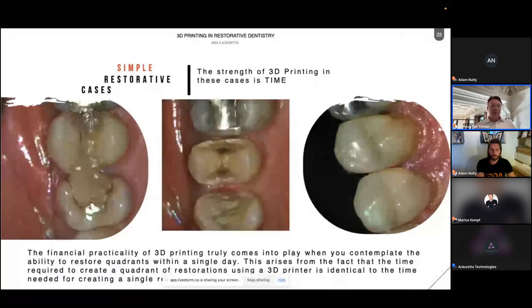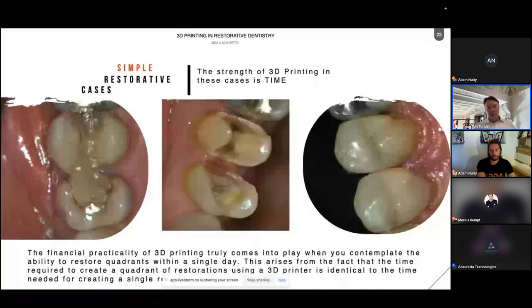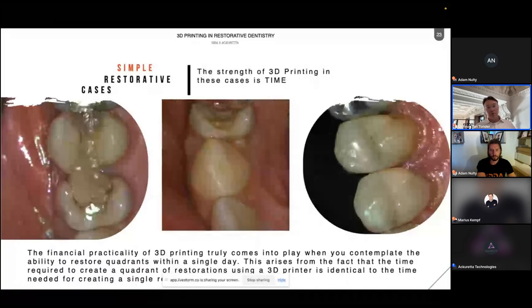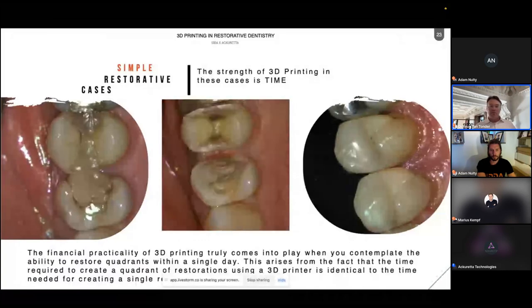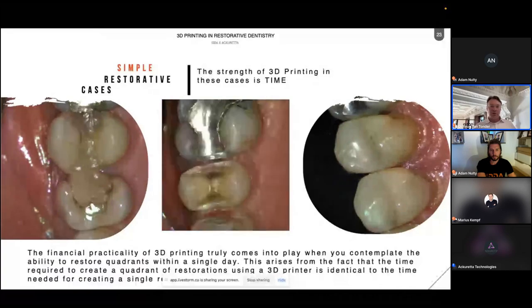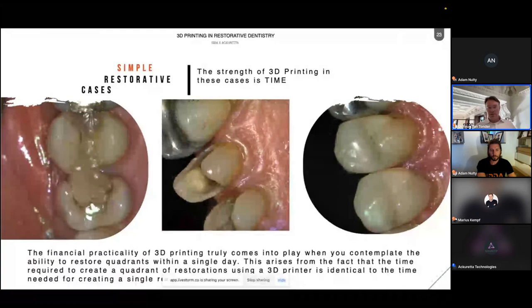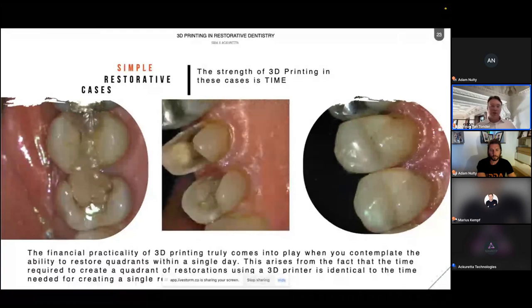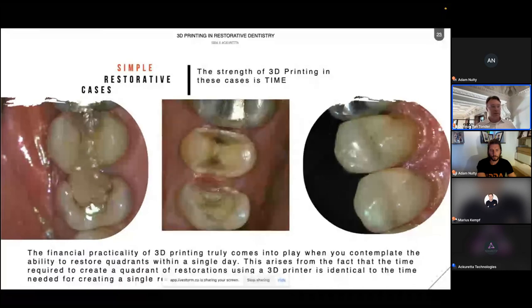So until we have really, really long-term effective studies on these intraorally, and I'm not talking about in the lab, I would just be very, very careful with the patients that you use it on. But saying that, the potential of the technology is amazing. So we really need to embrace this as the future of where things are going.